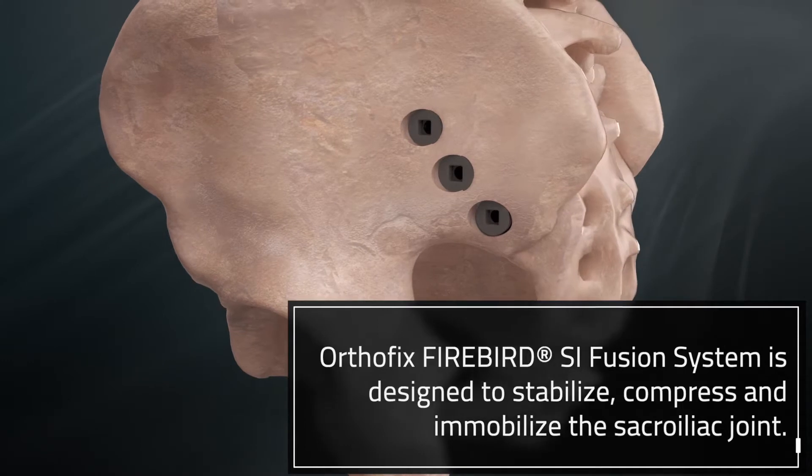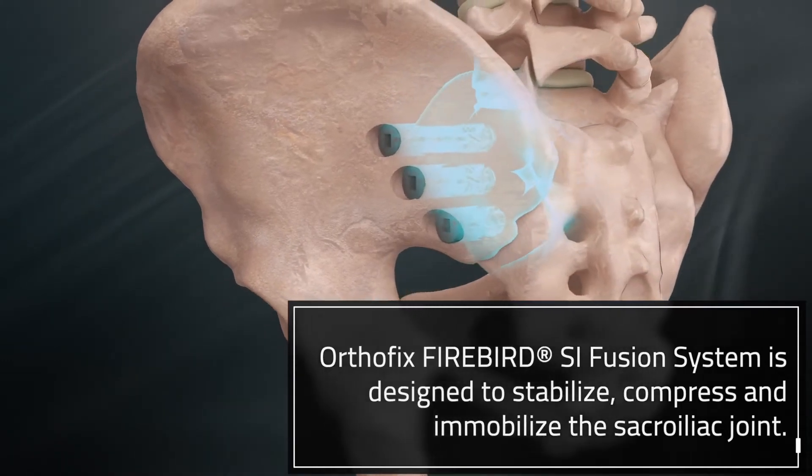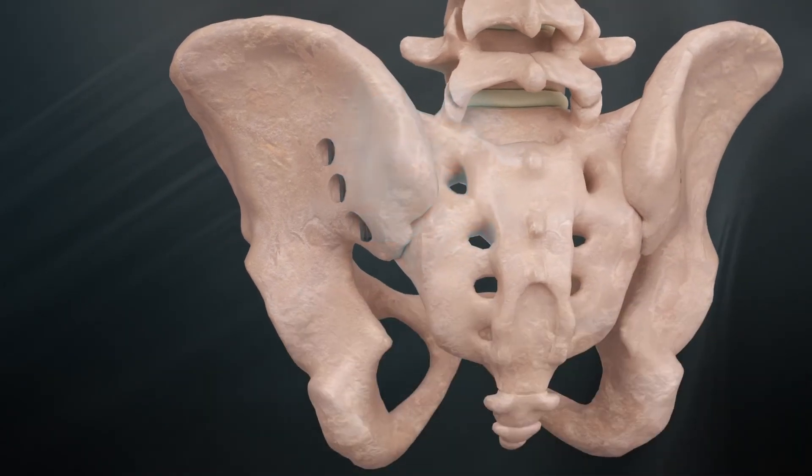The Orthofix Firebird SI Fusion System is designed to stabilize, compress, and immobilize the sacroiliac joint so your patients can get back to what matters.